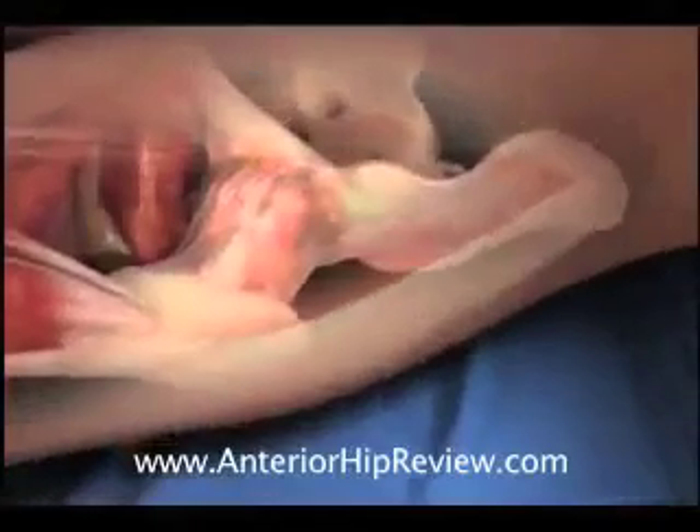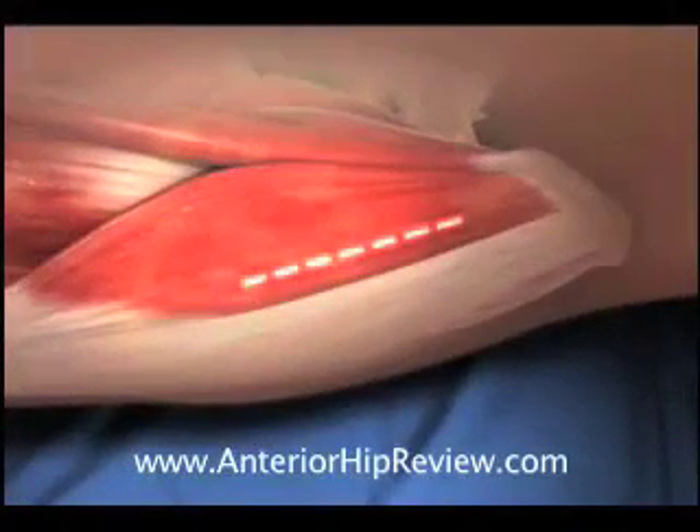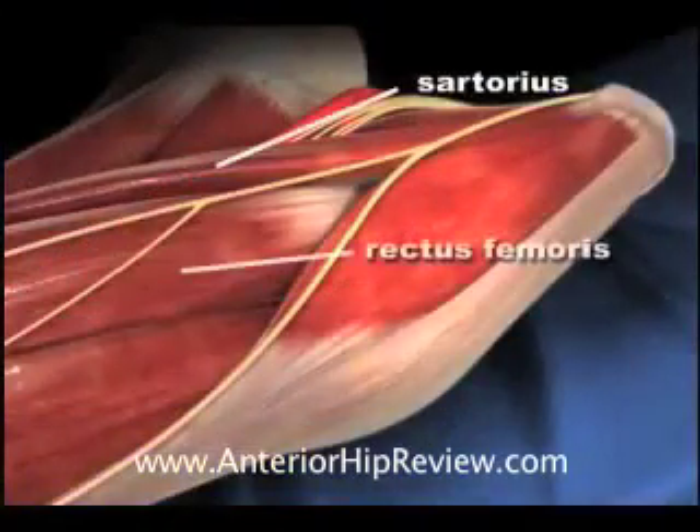Hello, this is Dr. Gallagly narrating an animated demonstration of a direct anterior minimally invasive total hip arthroplasty. The incision is made with the patient lying flat on their back, is 8 centimeters in length, and avoids the anatomic structures that are pointed out in the course of the animation.